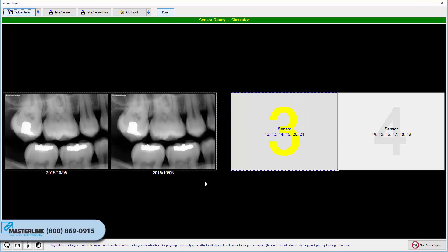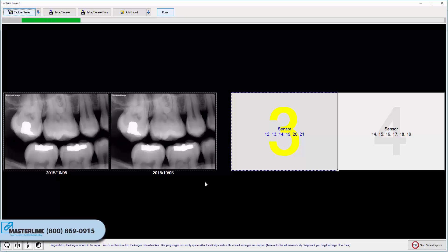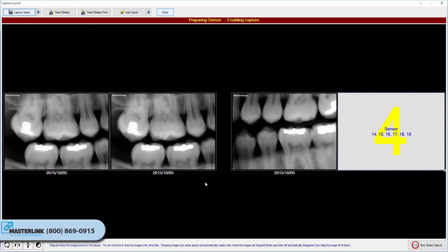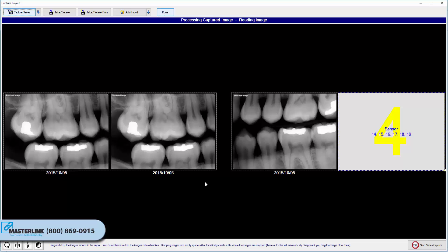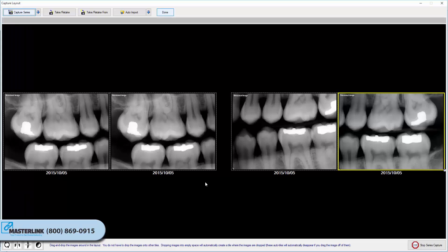The application will then advance to the next tile in the series. If Continue using this sensor/source was selected, the hardware will automatically be prepared and readied for the next Capture. If not, the user will be prompted to select a source for the next image file. Repeat the capture process until the last image in the series has been captured.